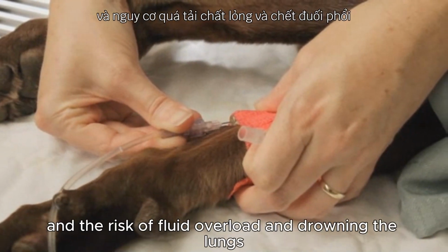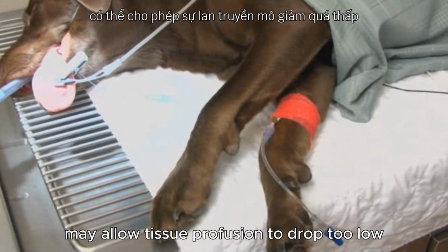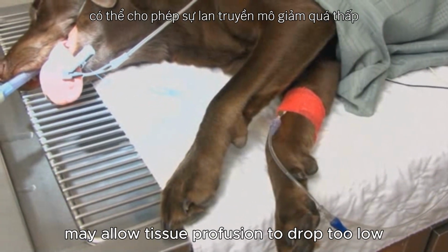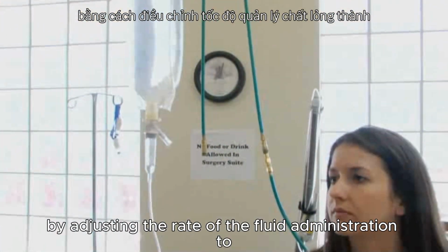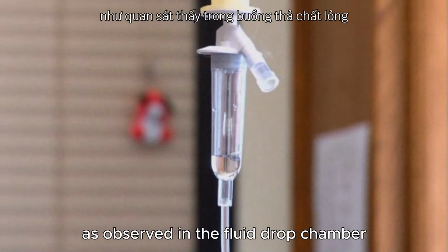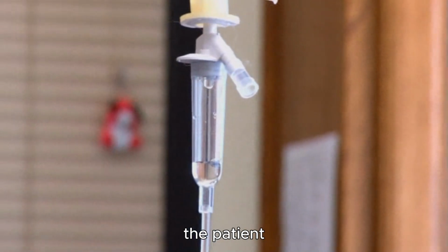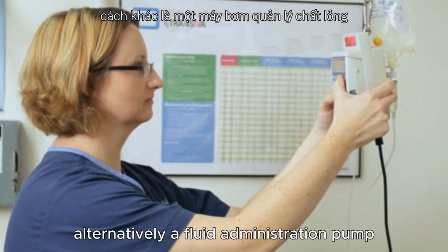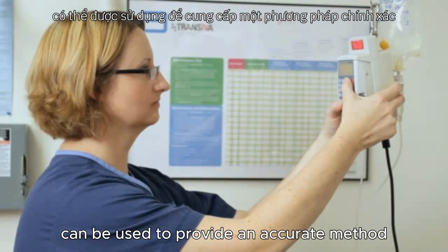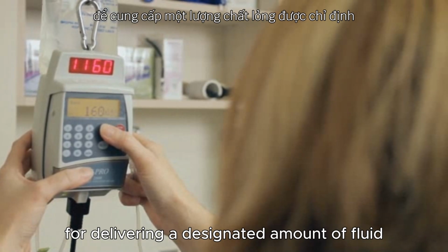Too much fluid risks fluid overload and drowning the lungs. Too little fluid may allow tissue perfusion to drop too low. By adjusting the rate of the fluid administration to a predetermined number of drops per minute, as observed in the fluid drop chamber, a predetermined amount of fluid is delivered to the patient. Alternatively, a fluid administration pump can be used to provide an accurate method for delivering a designated amount of fluid.